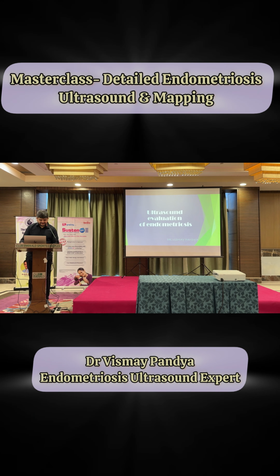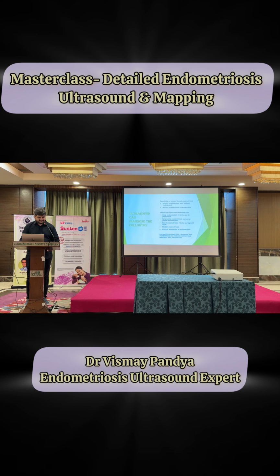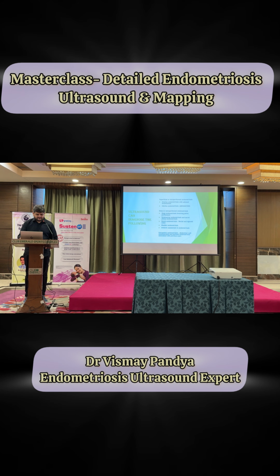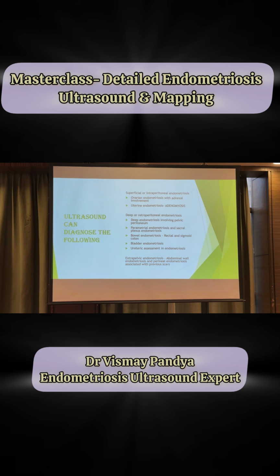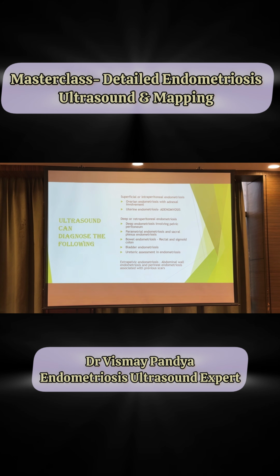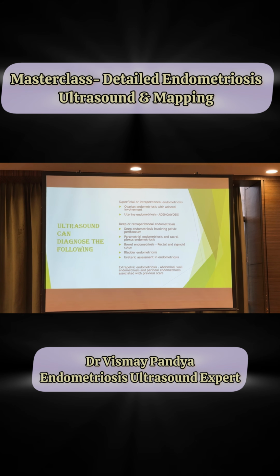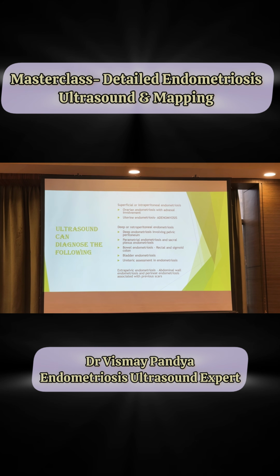Starting without further ado, as you can see from the ultrasound, we can diagnose all the following endometriosis. We divide into superficial or intraperitoneal and the deep or retroperitoneal. In the superficial, we have the ovarian and the uterine, the adenomyosis, and deep we have all the parametrial endometriosis, the peritoneal endometriosis, bowel, bladder, and the ureter.